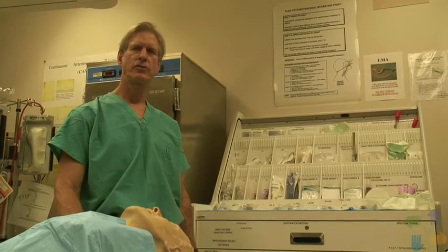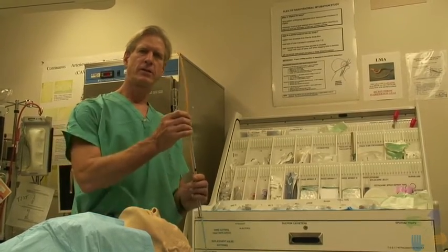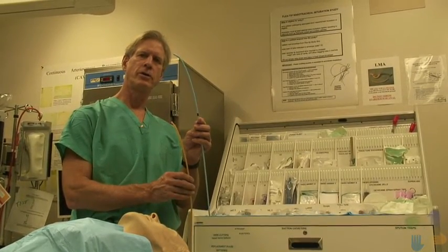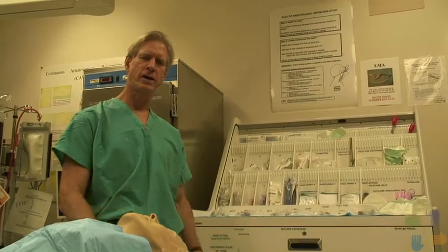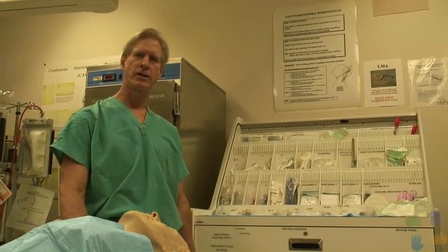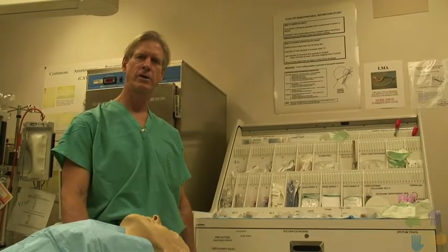Today we're going to be doing an instructional video on the use of the bougie in the difficult airway. This is a classic gum elastic bougie. A disposable tracheal tube introducer is also used in this setting. We're going to be going over the basic techniques and also some of the troubleshooting maneuvers if you're having difficulty with placing the bougie or the endotracheal tube.